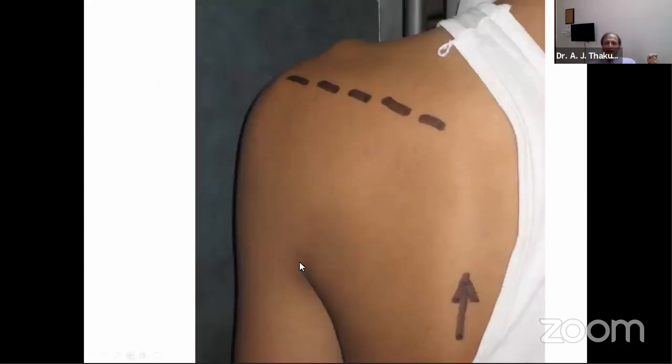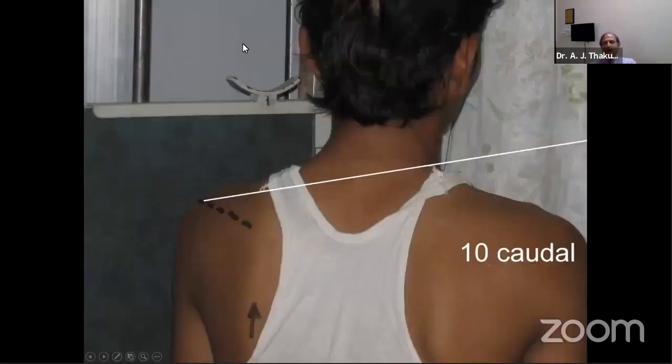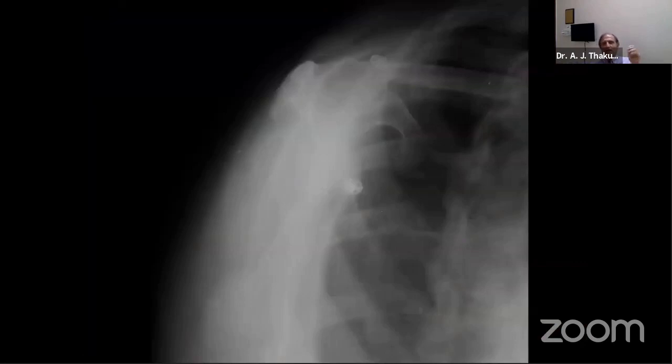Here we have marked out the spine of the scapula, and this is the vertebral border. These two, and now we have positioned this dotted line at right angles to the X-ray film, and then take an X-ray, caudal 10 degrees, and we'll get a perfect lateral. We get something like this, and one needs to see where is what.